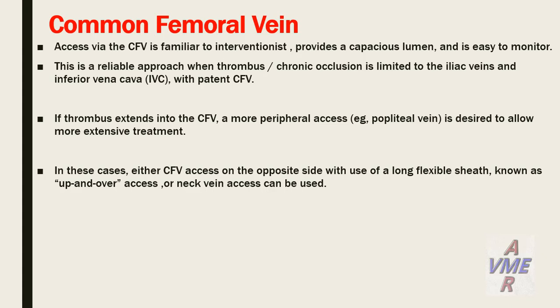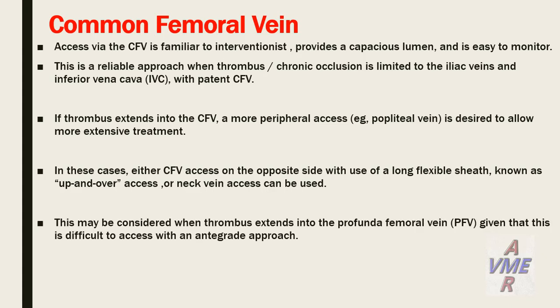The common femoral vein has a good lumen, a good diameter, and has bony support. You can apply pressure against it. It is a suitable access for the iliac lesions, whether acute or chronic, and for the IVC, either for insertion or retrieval of the filter.